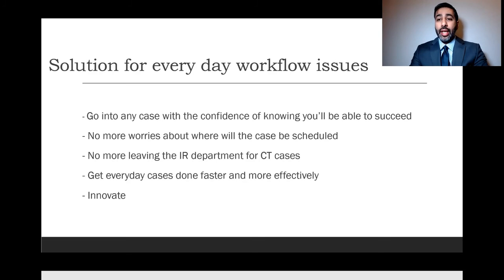You can bring it into that room, whether you're using CT, ultrasound, you know that you'll be able to get it done. The best part is not having to leave the department for it. It's really solved a lot of our institution's workflow issues in regards to us having to go to the diagnostic CT scanner and then competing with the ER and our outpatients and working with staff, non-interventional staff.